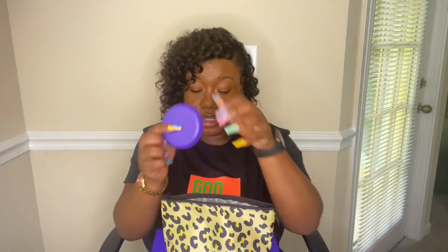The first time I went out to eat since I've had my aligners, it made me want to create a little kit on my own, so that I'm not having to have the different things all out and over the place. So what I did was I went to the store and I got this little mini makeup bag, makeup kit. And in here, I keep my little aligner case. So when I'm out to eat, I can run to the bathroom, remove my aligners, and place them in here.